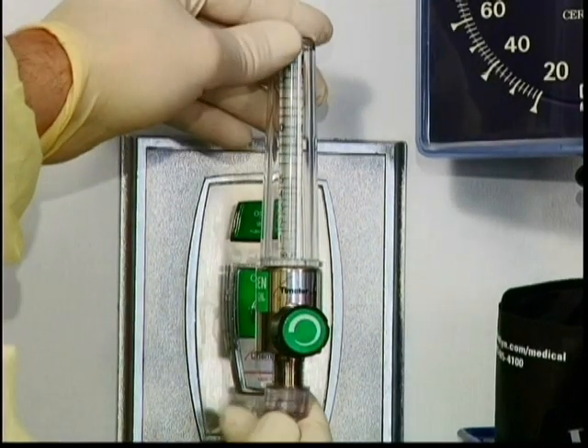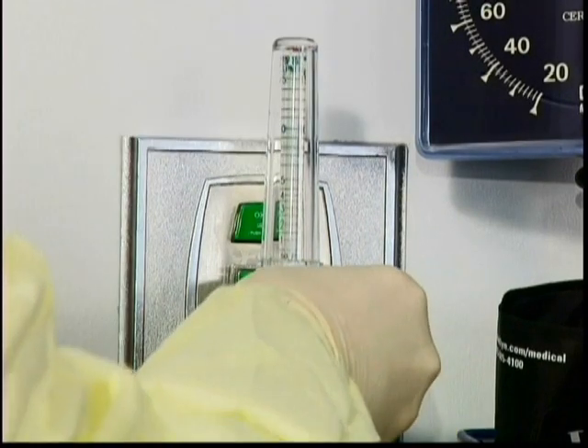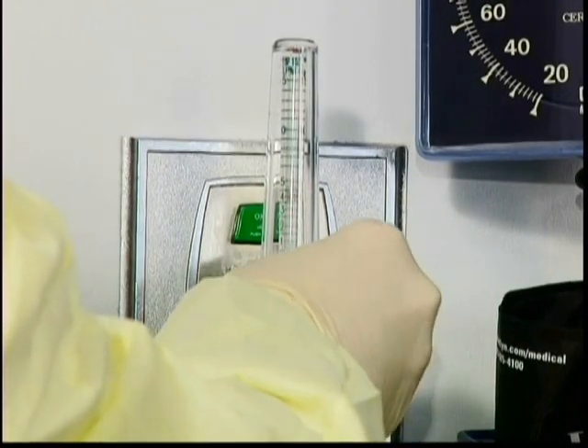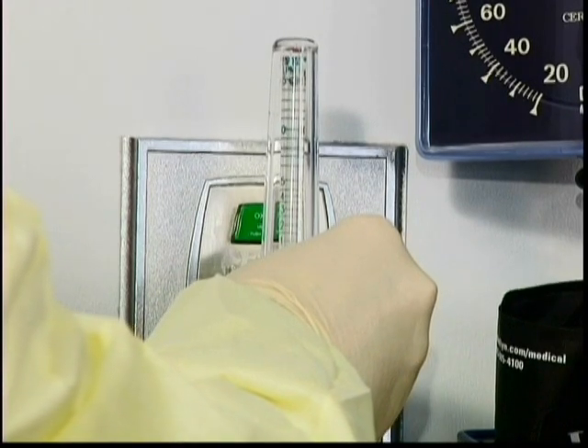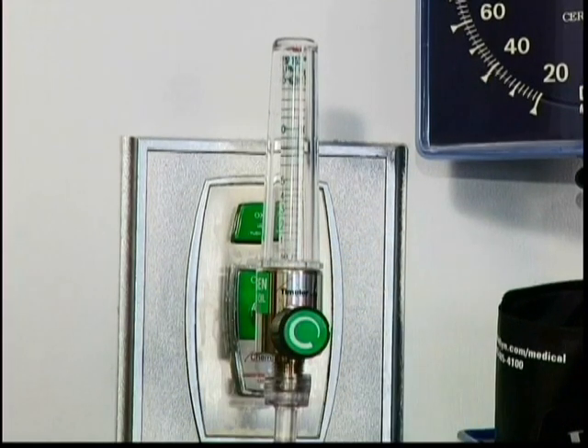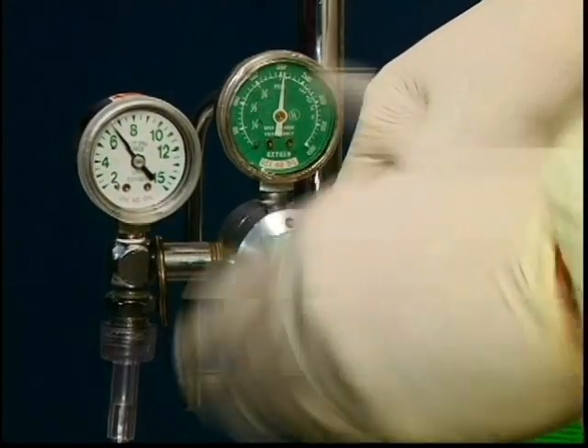Bagging patients is frequently used to provide 100% oxygen to critically ill patients. Therefore, the oxygen flow needs to be set at a minimum of 15 liters per minute. This is demonstrated here by adjusting the flow rate until the float reaches at least 15 liters per minute, whether the flow meter is attached to the wall or you are using a flow meter attached to an oxygen cylinder.